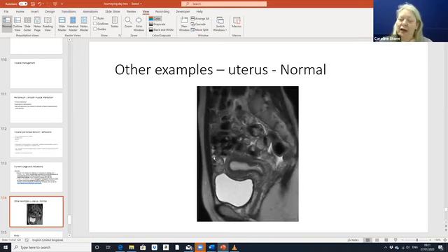Now, as I might have said before, the MRI is taken as a series of slices, shots, a few seconds apart. So although the person is breathing quietly, with all this peristalsis ongoing through that quiet respiration, because of the way that they splice the video, it's all a bit jittery and jolty and a bit quicker than it would ordinarily be. So just take that into account. But nonetheless, there is this constant activity in the intestines and also the bladder and other organs all the time, depending on the stage of filling with the bladder, but that's a separate talk.